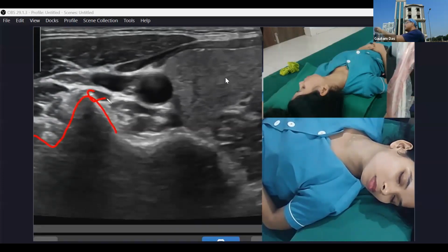So here, this is the longus capitis muscle, this is the longus colli muscle. So you have to inject here above the longus colli muscle. You can come from here, or through here, or from here above the longus colli muscle. Normally, the drug will spread around it and cover the sympathetic block. But at this level, if you are blocking, you have to give a larger volume. But this area is safer because important arterial structures, vertebral artery and inferior thyroid artery, are not there.